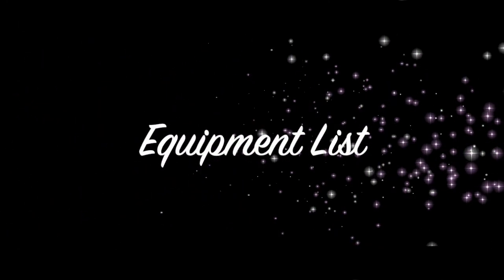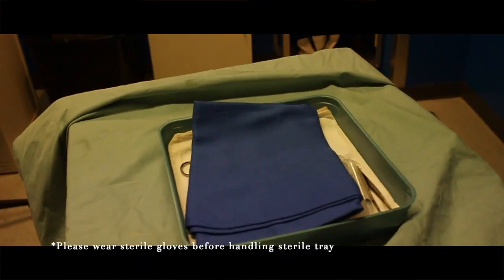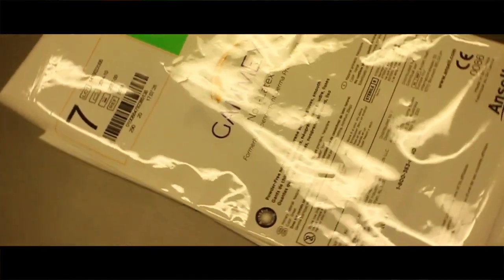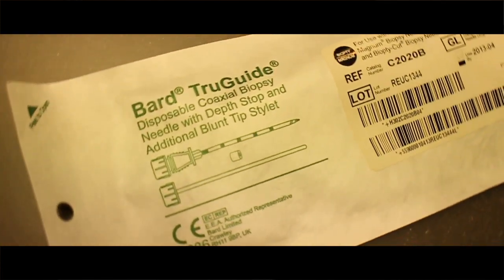Well, the first thing we will need is a sterile tray that contains some sterile drapes, some sterile towels, some sterile syringes, and some sterile containers for containing anything that we will need for the procedures. We will also need some sterile gloves. We will need a biopsy needle that is sharp enough to penetrate through the weight-bearing joints that we are imaging for this procedure.